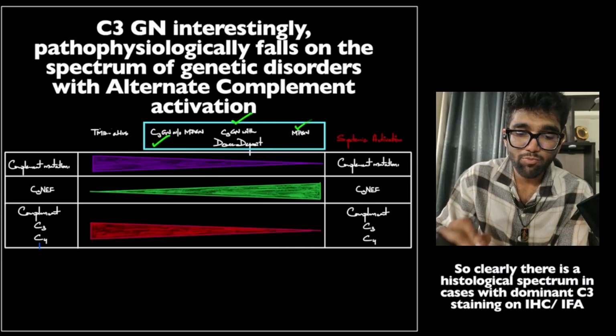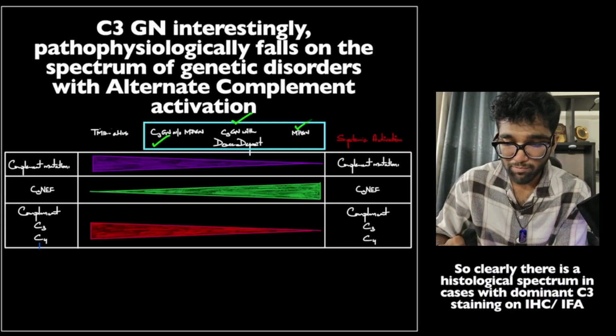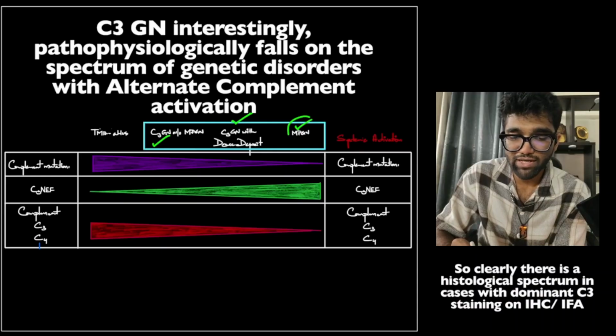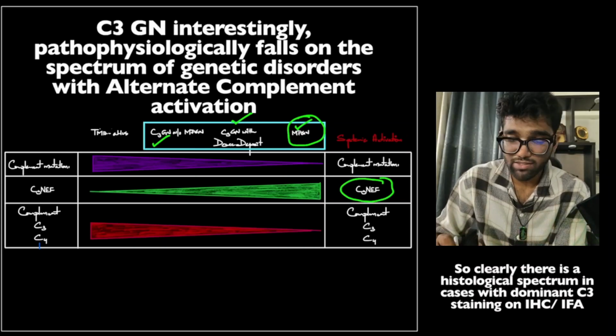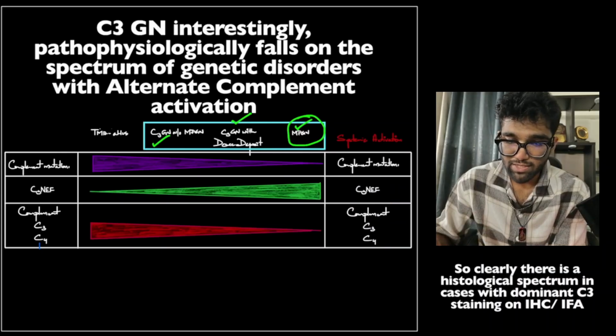And then we have membranoproliferative, that is proper proliferative changes with basement membrane thickening, again with dominant C3 deposition. Okay, and we discussed previously that it is patients with these proliferative glomeruli that stain dominantly for C3, that show the highest prevalence of C3 nephritic factor in the serum and the lowest C3 and C4 levels. So I hope that much is clear.